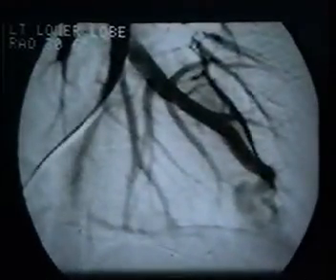If we're going to use MR to look at this group of lesions, we really should, in our routine evaluation, not only use spin echo images, but use gradient refocused echoes as well. Just to show you the angiogram, in this particular case, you can see there's obviously an AVM in the periphery of the lung.